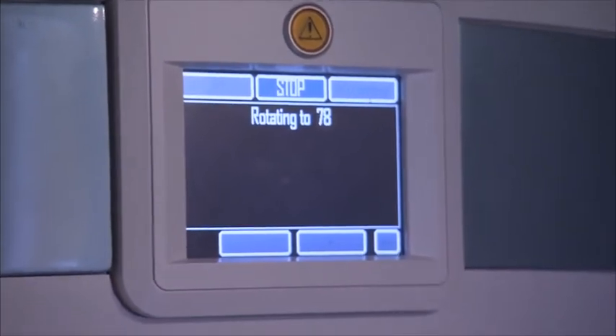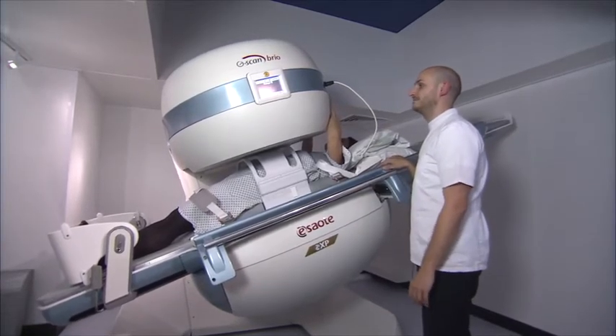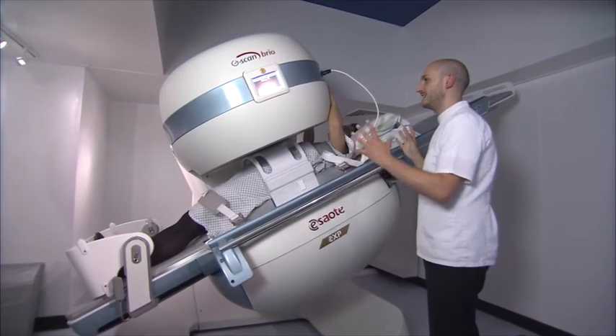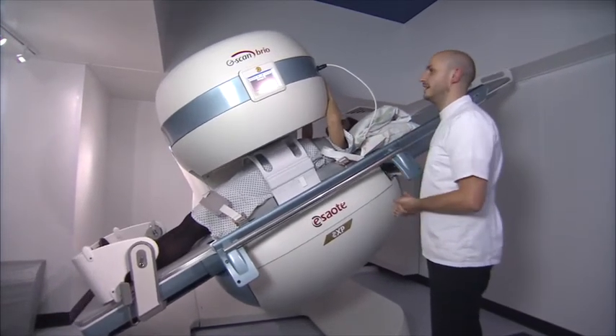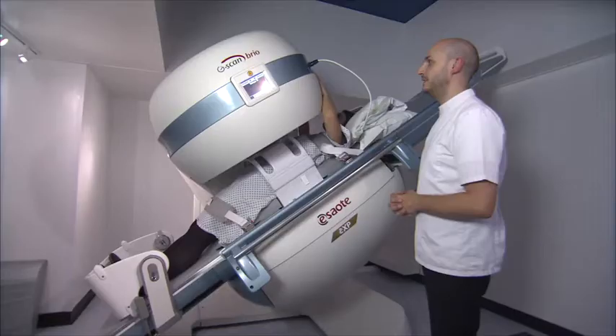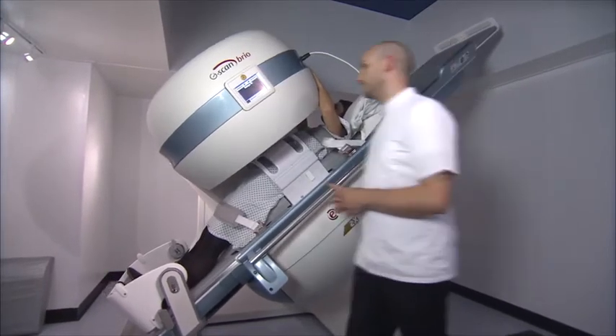Once we've got the patient in the right place, we press a couple of buttons on the side which tilts the magnet upright. It then remains stationary with the patient in position for about six or seven minutes while we do the weight-bearing scan. Once we're happy with that scan, we come back in, lie the patient back down again, and proceed with the supine examinations.